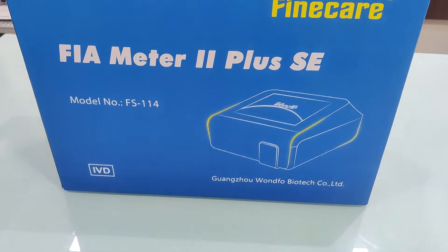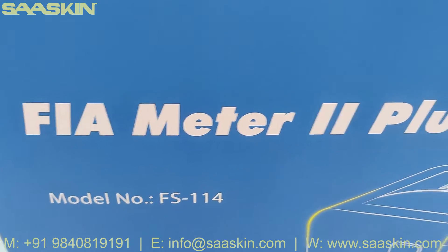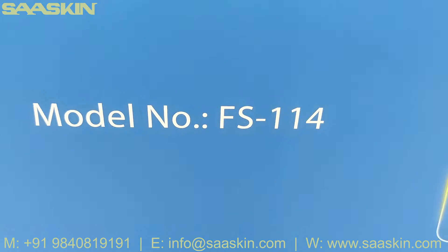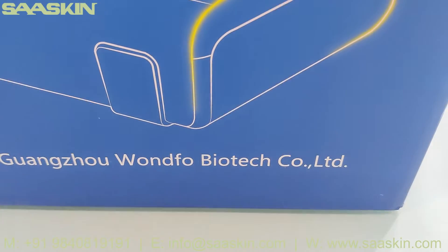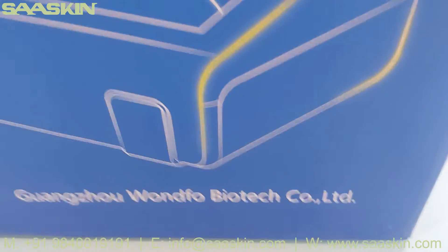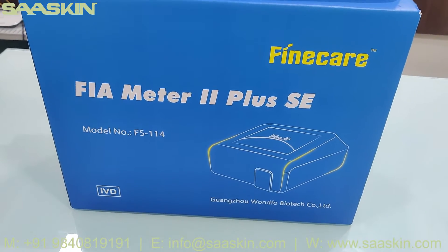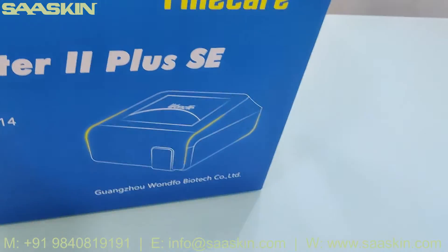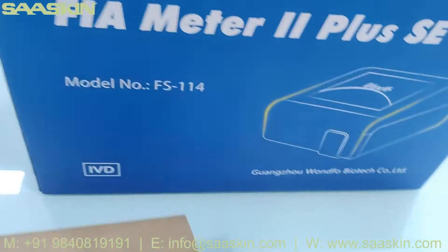Hello everybody, today we are going to see the unboxing of FineCare FIA Meter 2 Plus SE. You can see this is the model FS114. This is from Guangzhou Wondfo Biotech Company Limited. This is Wondfo FineCare. This is the fluorescent immunoassay meter, which is used to connect different fluorescence. Along with this machine, you get one additional kit also.